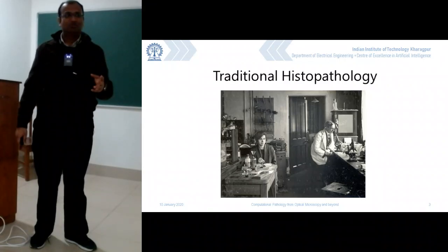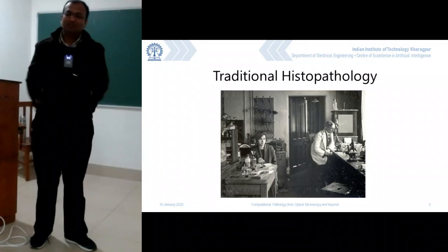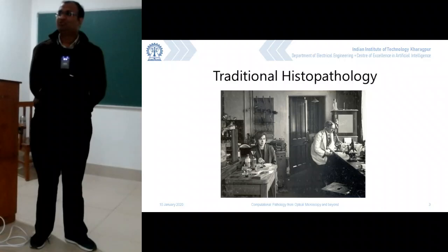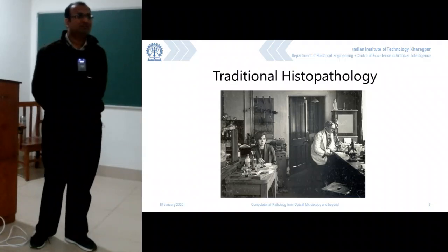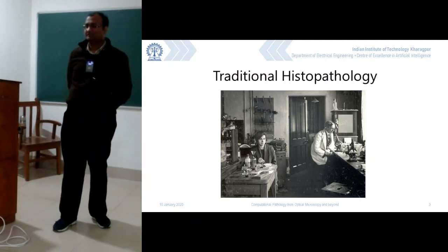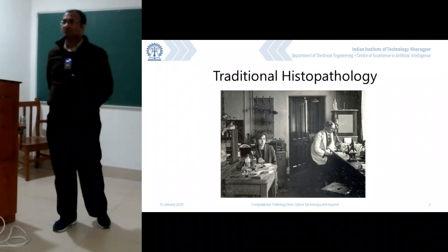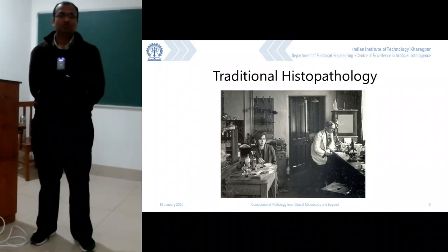And if you go over to molecular stains, then it's a very different ball game. In fact, for molecular stains, most of the time they are not even read by histopathologists. They are read by people who have a PhD in molecular biochemistry, because there is a whole different way of biochemistry which goes in over there to explain which molecules are present. So certain stains around a certain anatomical structure would mean a certain thing, and it's not a vanilla rule which will apply to all of them.